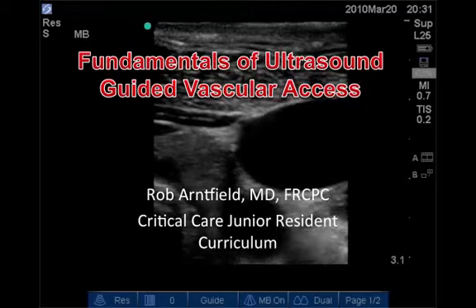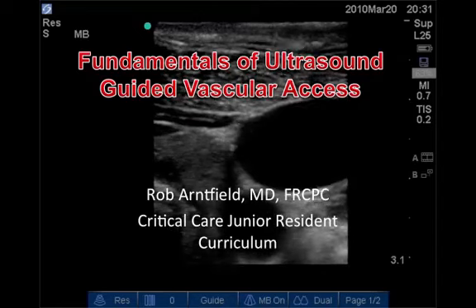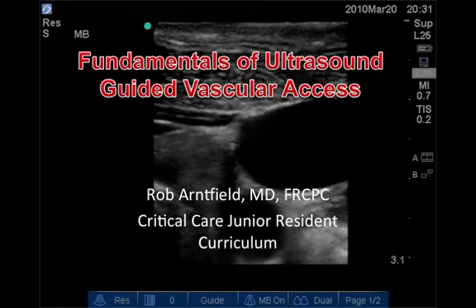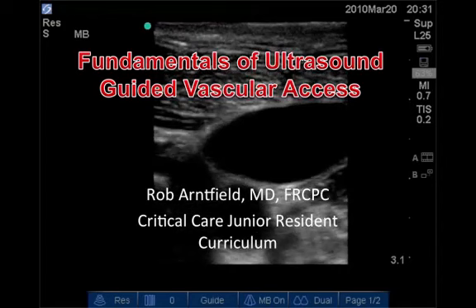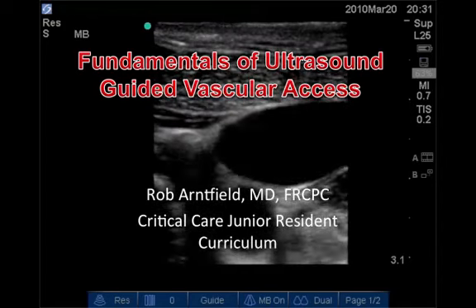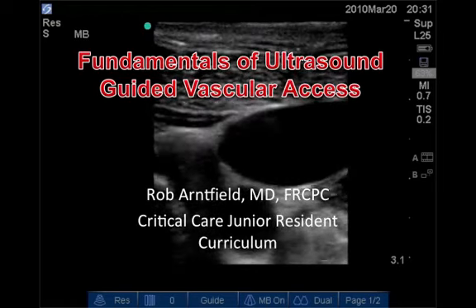Hi, it's Rob Arntfield speaking to you, and this will be the screencast covering the fundamentals of ultrasound-guided vascular access. As a complement to your ICU junior resident rotation, this will be one of the most important procedures you'll perform throughout your rotation, and one of the most frequent procedures you will perform as well. So I ask and thank you for your attention as we go through some of these details.